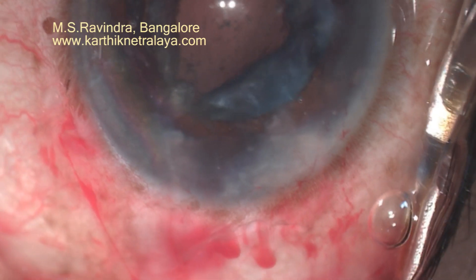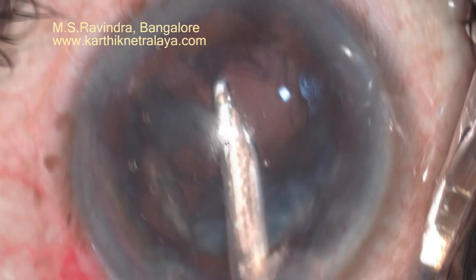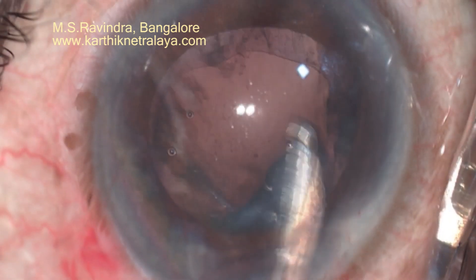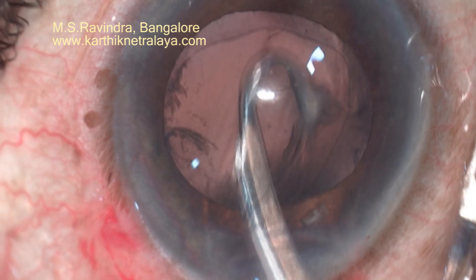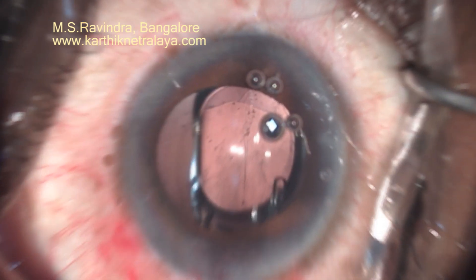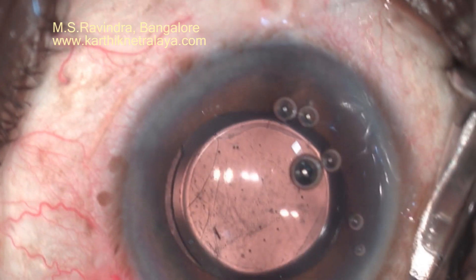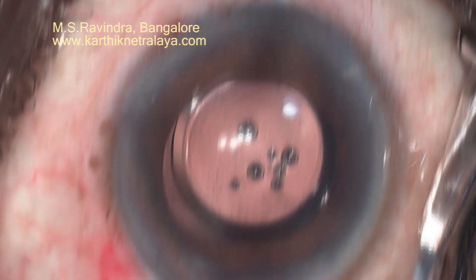As you can see, the tunnel has to be opened up with the cannula. Press the tunnel floor and direct the nucleus in parallel — keeping the cannula parallel to the cornea rather than parallel to the iris is very important; it opens up the tunnel maximally. If you keep the shaft of the cannula parallel to the cornea, the tunnel opens maximally. After cortical aspiration, inject the IOL into the bag. There is a runoff on the left side; ensure you are not applying excessive pressure in that locality.